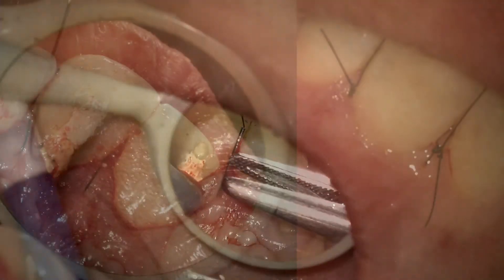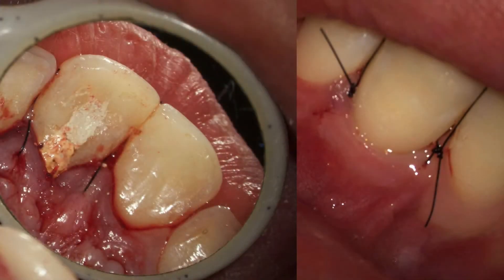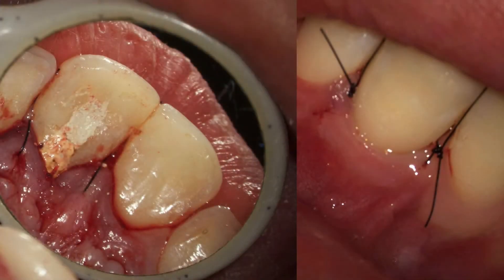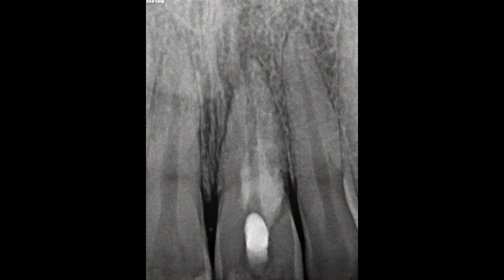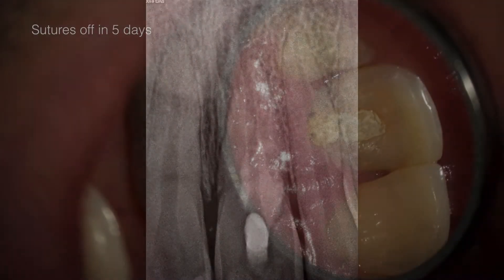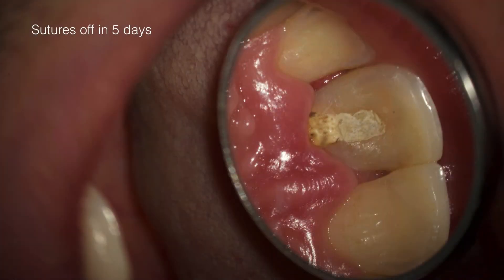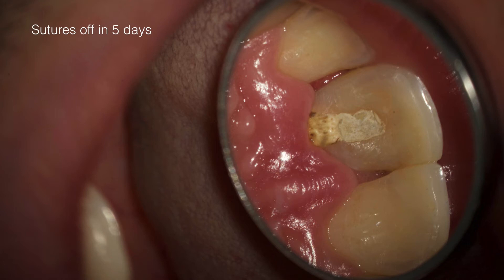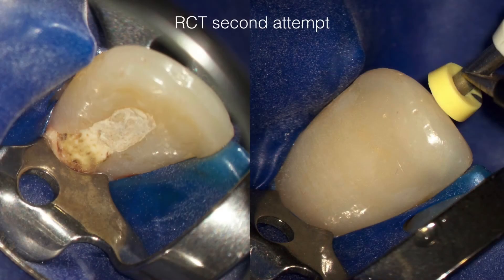We then sutured the flap. After 5 days, we removed the sutures and continued with the root canal treatment.